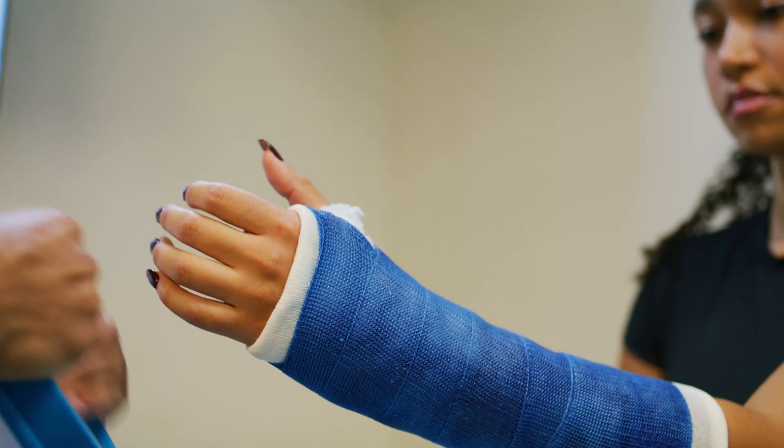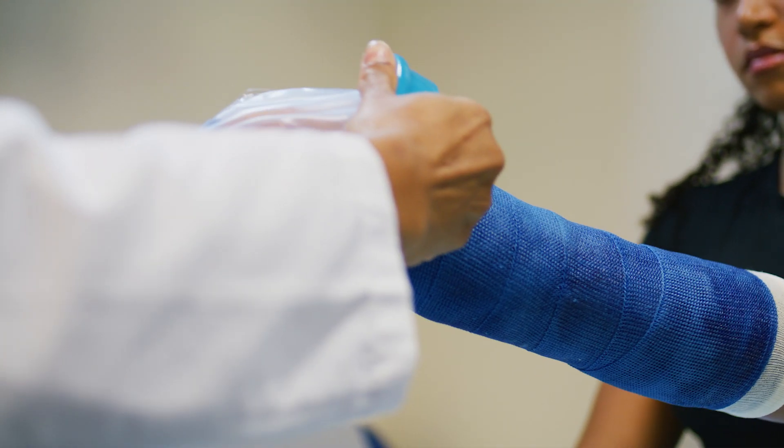Check the skin around your cast or splint regularly and never stick an object inside the cast to reach an itch, as it may get stuck. Always use two layers of plastic or a purchased cast cover to keep your cast dry in the shower or bath.